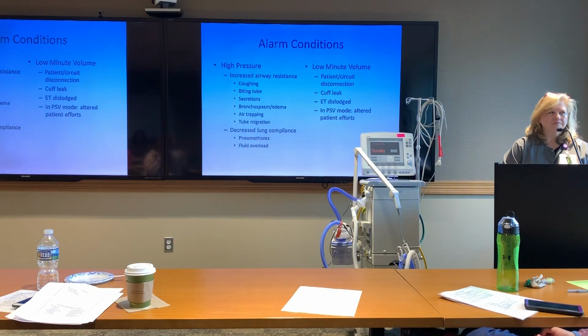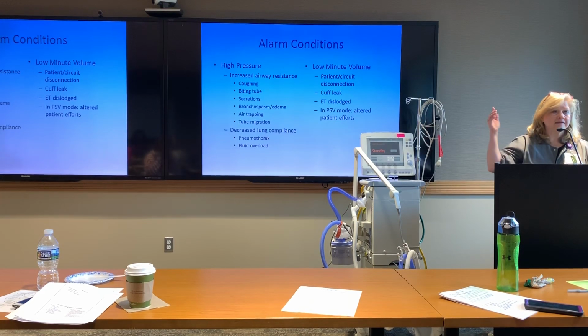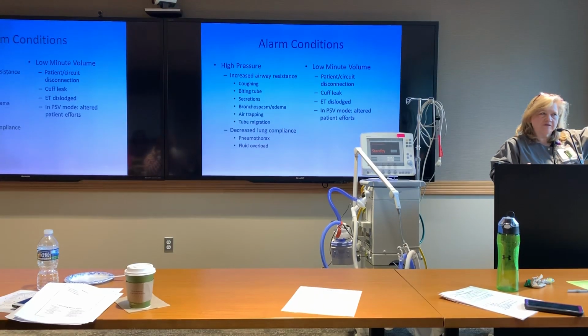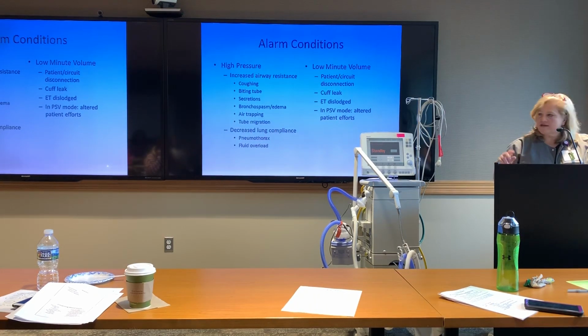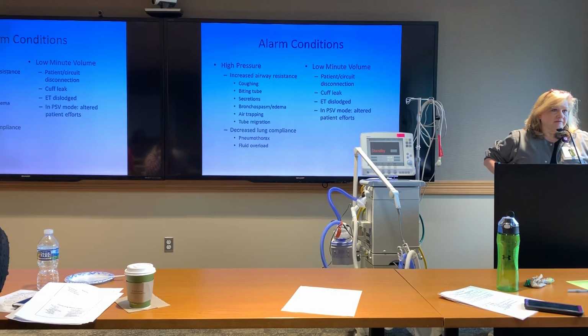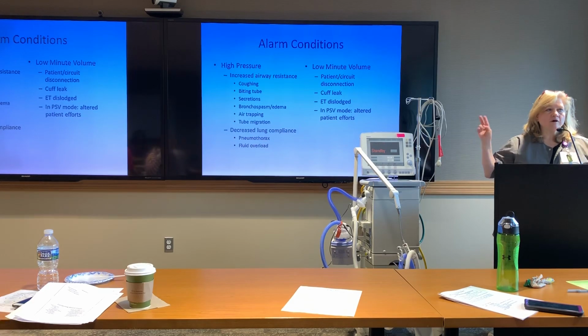Same thing with the, like I said, the monitors. I always counted on the monitor alarm, the respiratory rate from the monitor. I look at that a lot, because if that's different than what's on my vent, it's because the monitor picks up muscle activity, right? So if my vent is doing what we would call autocycling, just triggering even though it's not supposed to be, that can happen.